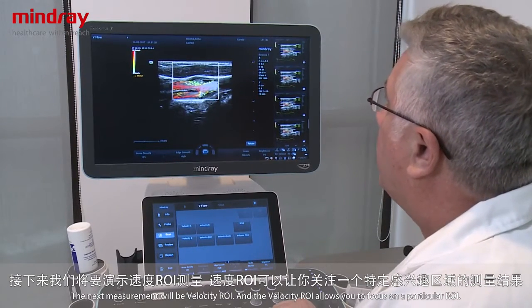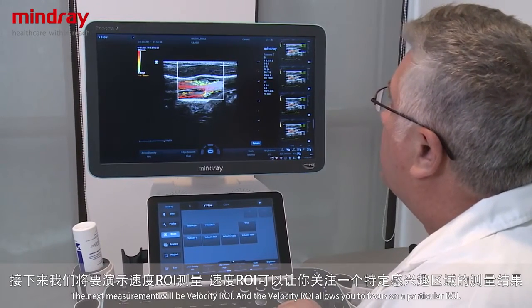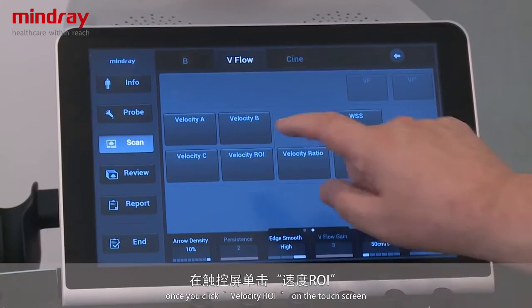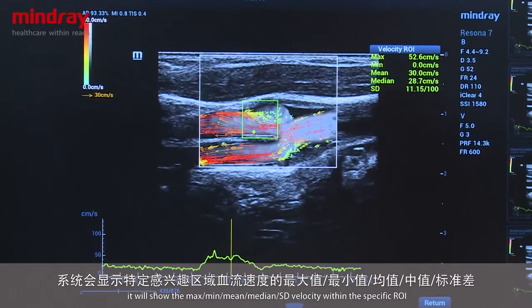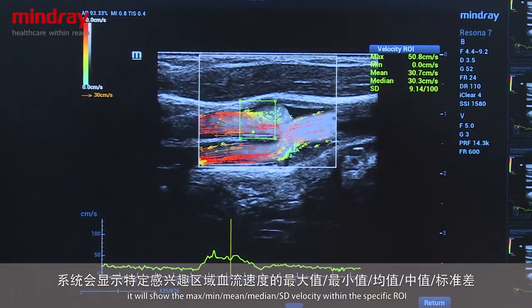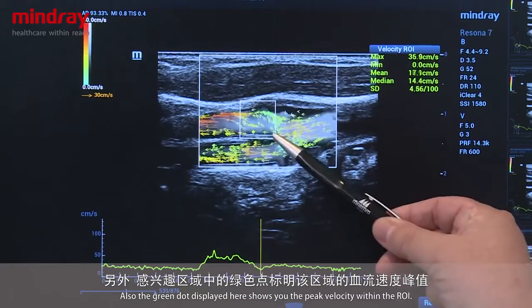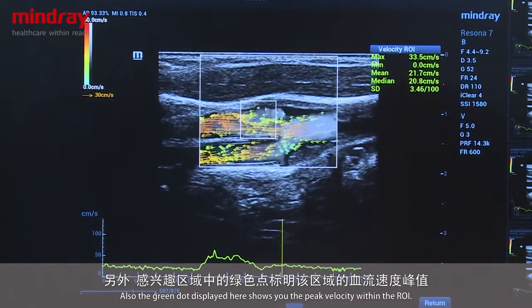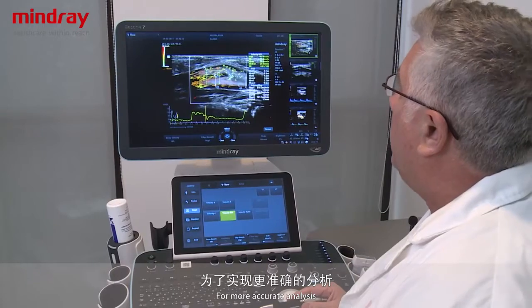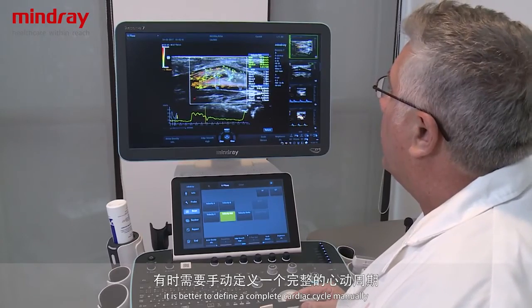The next measurement is velocity ROI, which stands for region of interest. Once you click ROI on the touch screen, it shows the maximum, minimum, mean, median, and standard deviation velocity within the specific region of interest. The green dot displayed indicates the peak velocity within that region. For even more accurate analysis, it is best to define a complete cardiac cycle manually.